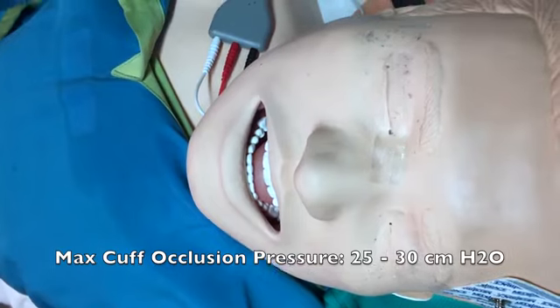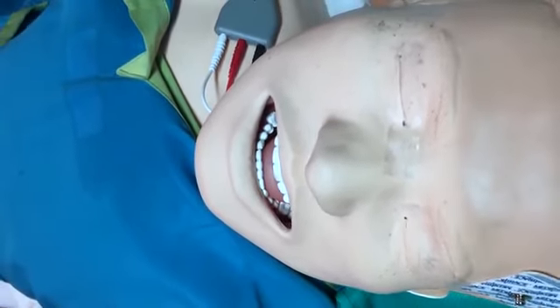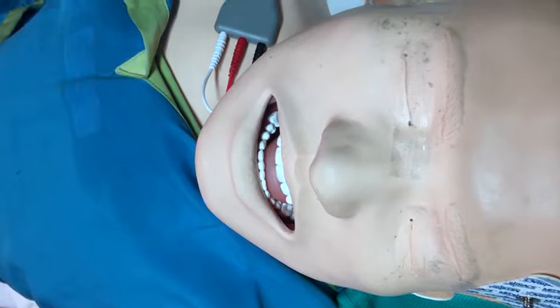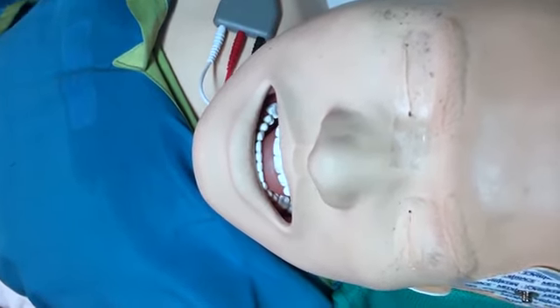Maximum occlusive pressure is 25 to 30 centimeters of water. And then there's an acronym called SMELLS that we use to identify if we're in the right place and if proper intubation has occurred. I'll talk about that in a bit.